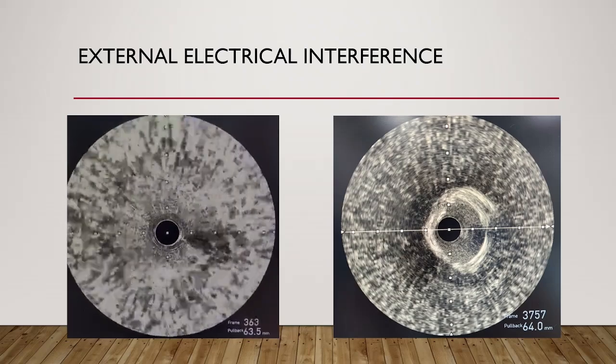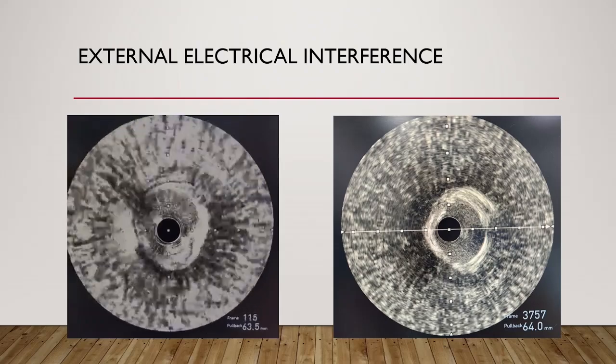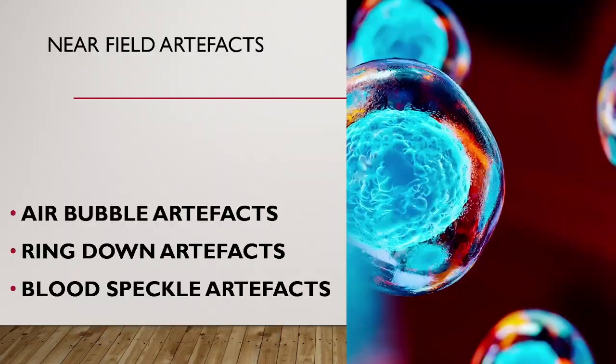This is typical of external electrical interference in the system. So you have to check your cath lab to get these things out. Otherwise, you can't interpret your images. This is the electrical interference of the vessel.